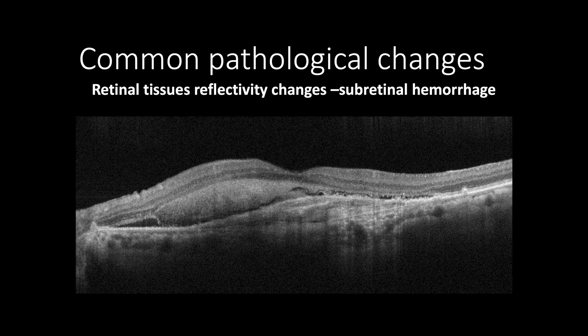This is a case of advanced neovascular age-related macular degeneration causing accumulation of subretinal fluids and blood, which appears as homogeneous hyperreflective with smooth regular borders casting shadow artifact.